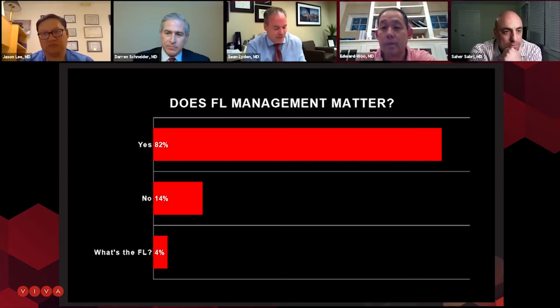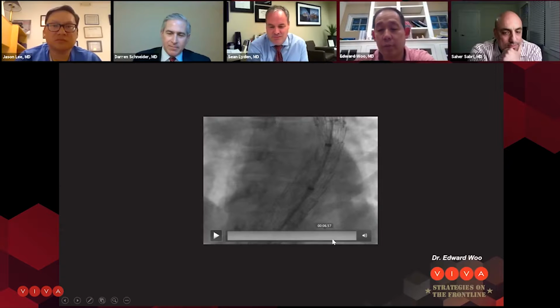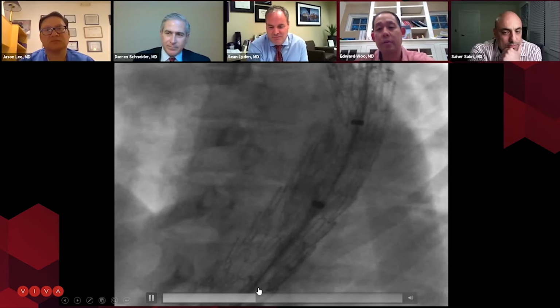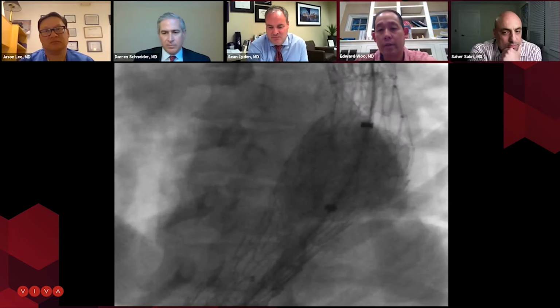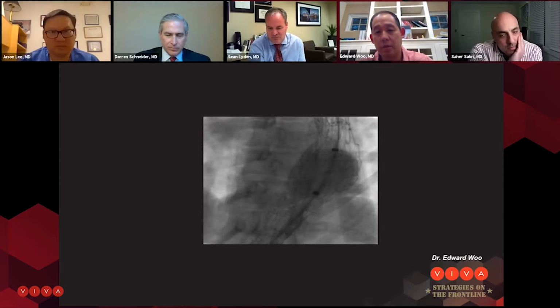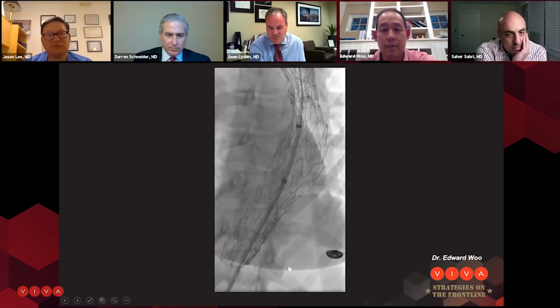So to keep us on time, Ed, let's talk about what you did after this. So what we did was what's called a Knickerbocker technique. We basically expand or balloon out that T-bar to appose that chronic flap against the thoracic aortic wall to close off that false lumen. You take a balloon and you go until it pops, and it's a little scary. And again, you can see what it looks like here.